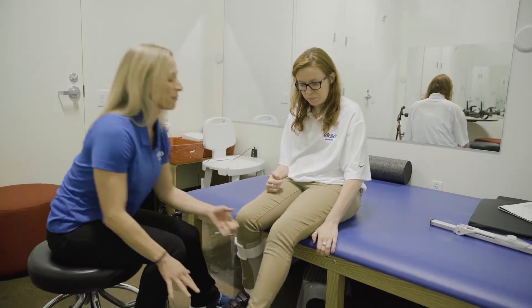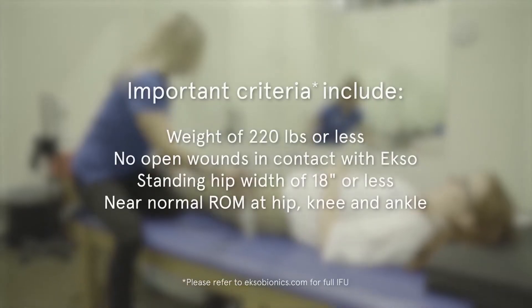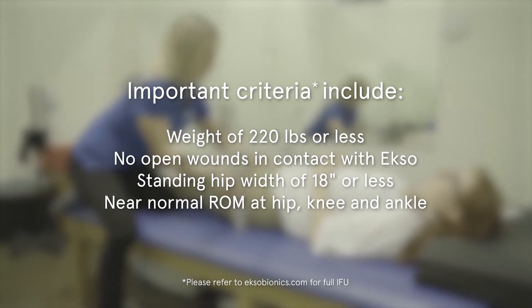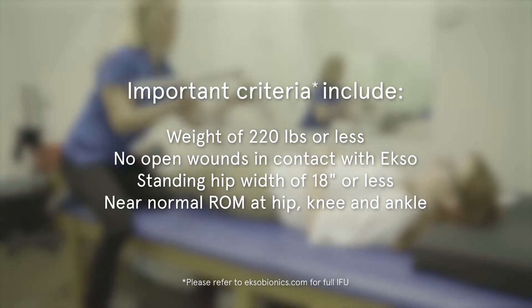Important criteria include, but are not limited to: weighing 220 pounds or less, having no open wounds in contact with XO, having a standing hip width of 18 inches or less, and having a near-normal range of motion at the hip, knee, and ankle.